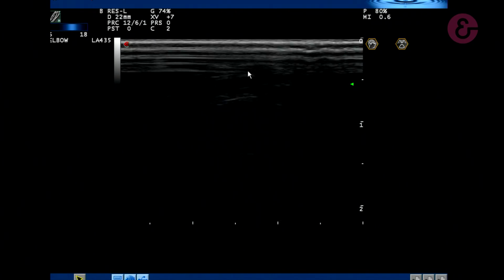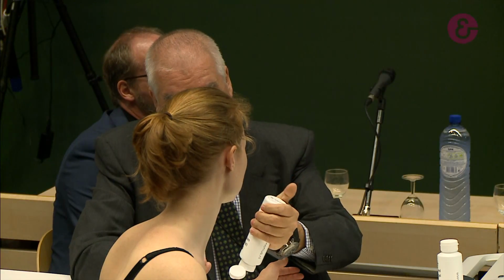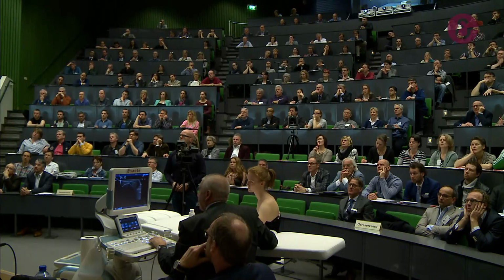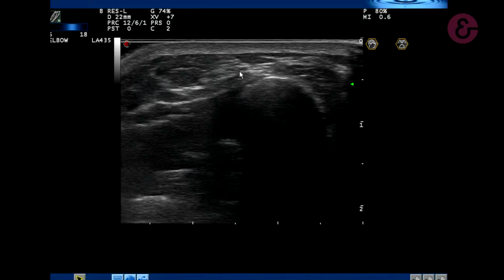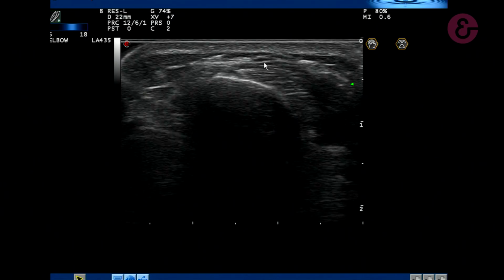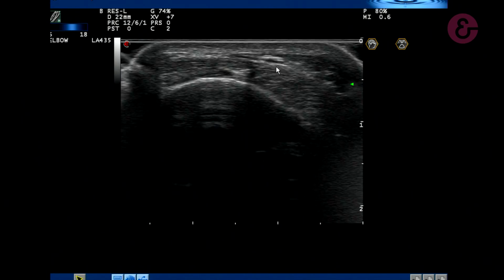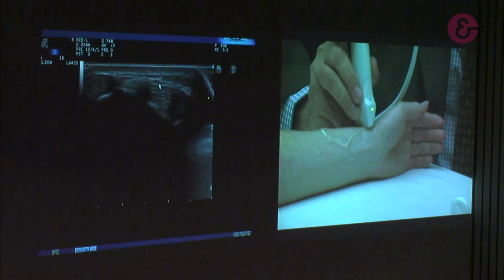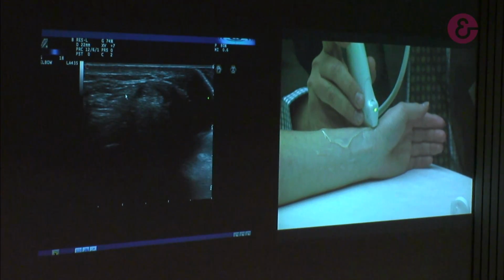So it can be followed after to the level of the crossing with the tendon, extensor tendons of the wrist, the first compartment. We can do that. We can try to locate the nerve and follow to the crossing. This one, and look to the, going on the other side. This one again. This is a tendon of extensor, first compartment, and this is the nerve, running close to the retinaculum.